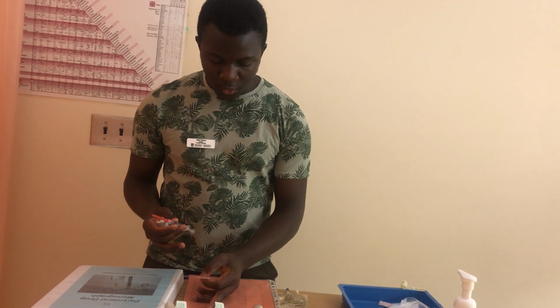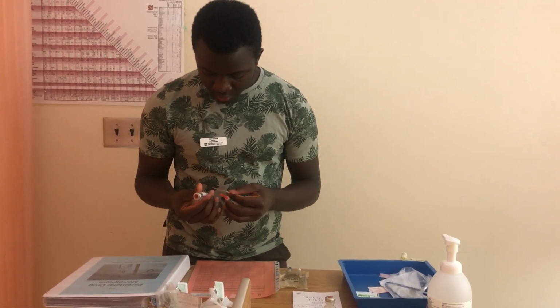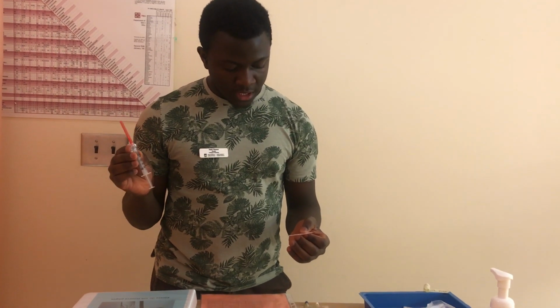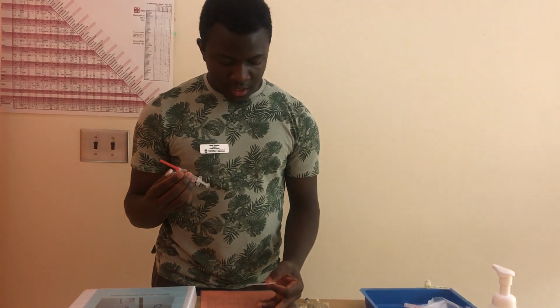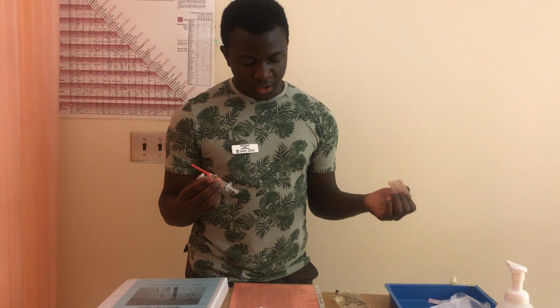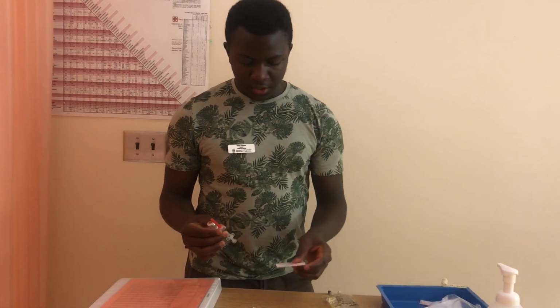So right patient, Whitson Emma, and the medication is methylprednisolone. I have here methylprednisolone, and the dose is 75 milligrams, which is equivalent to 1.5 milliliters. And this medication is going to be administered via IV. I'll be giving this in a mini bag IV. Frequency is every 6 hours, which makes the time 1400 now the right time to administer this medication. So my second check is done, and my medications are ready.